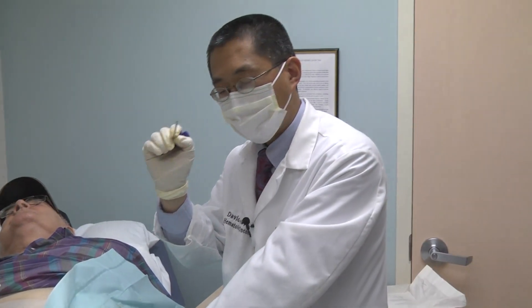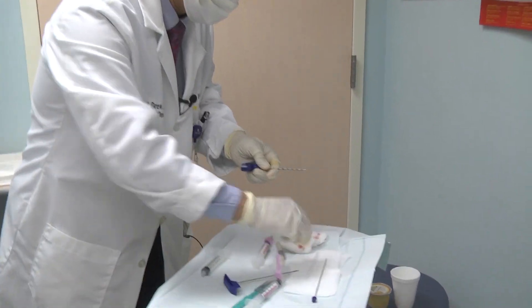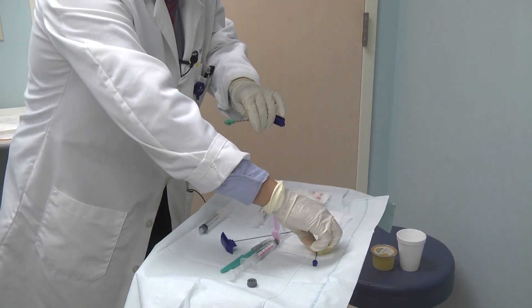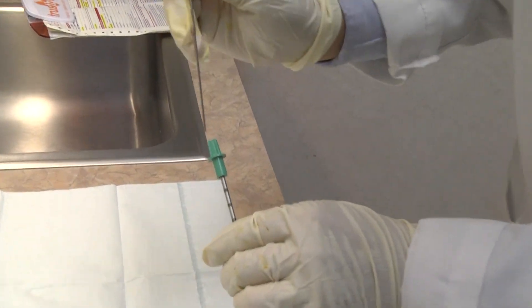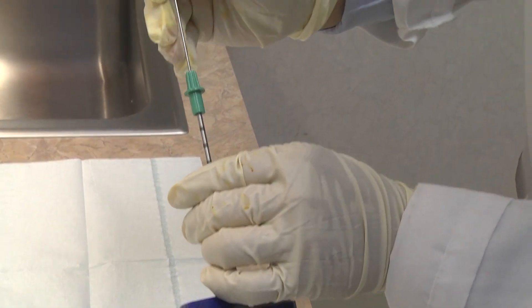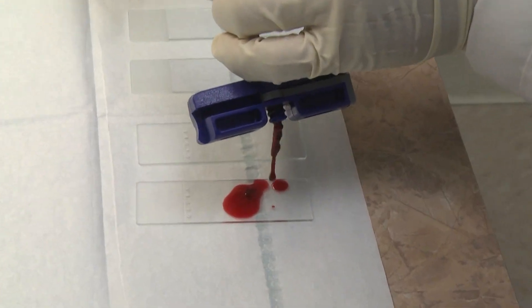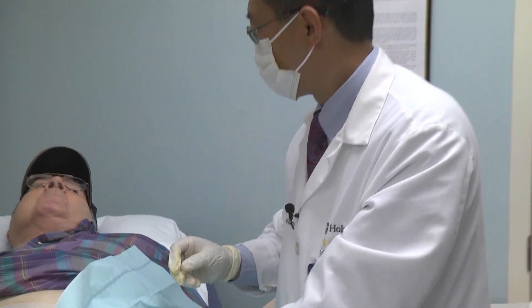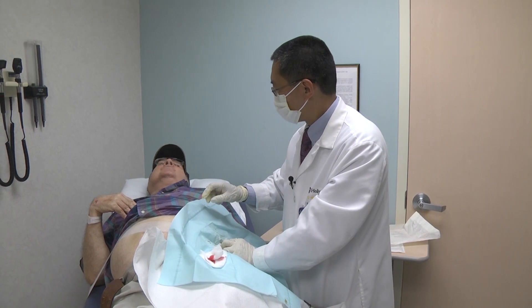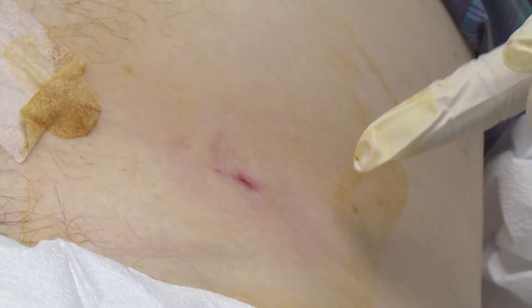I can see the bone from the cutting edge — you can see the bone. Don't touch here, I need to see if I have a good core. Always put a guard on. It's a big core — very nice. So it's finished. We'll clean it up. This is the final cut — see here, there's nearly no bleeding.